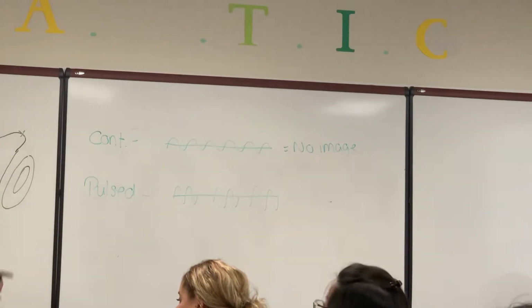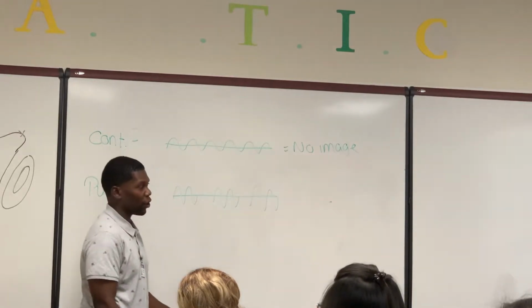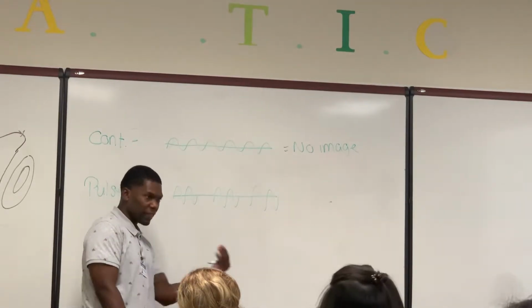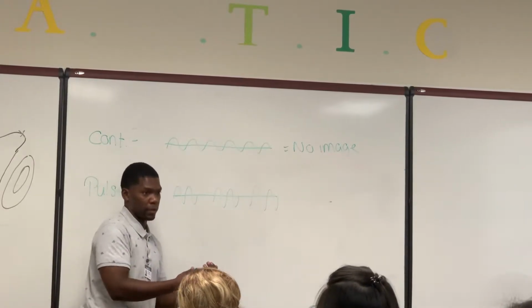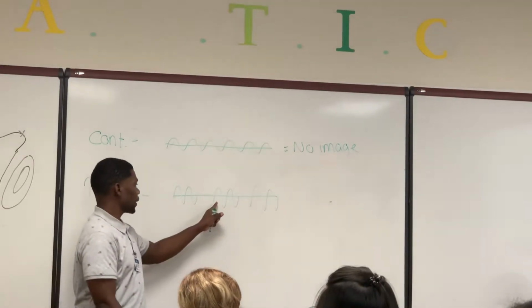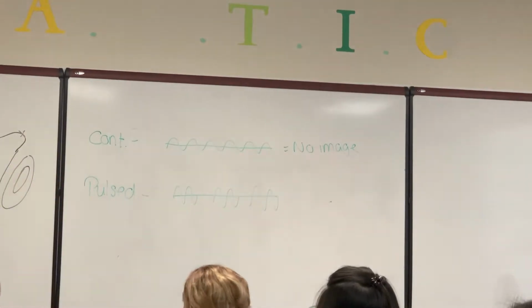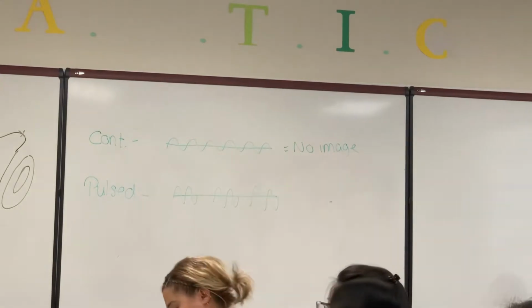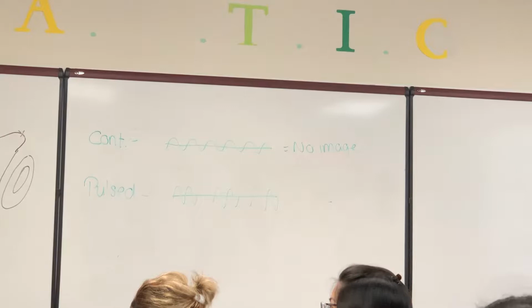So during that break time, the off time, or listening time, or receiving time, it's waiting on those echoes to come back. And then it's going to send out another pulse. Ultrasound assumes that's how it works: it sends out a pulse, that pulse goes out and comes back, then it sends out another one.